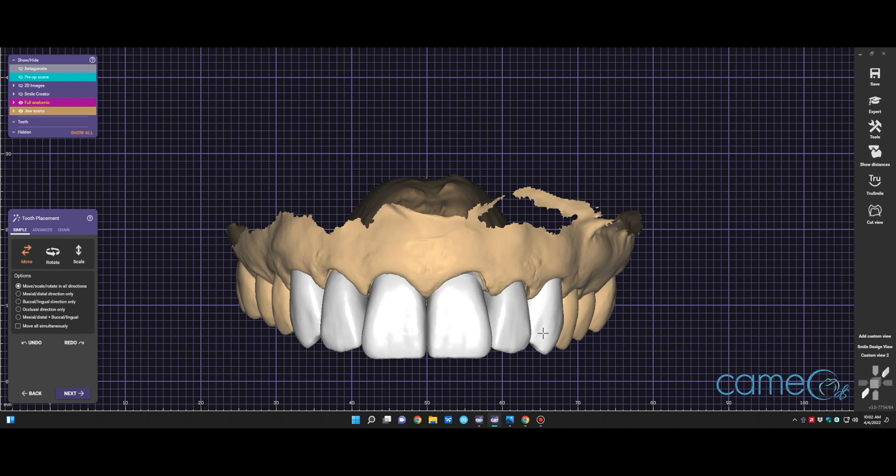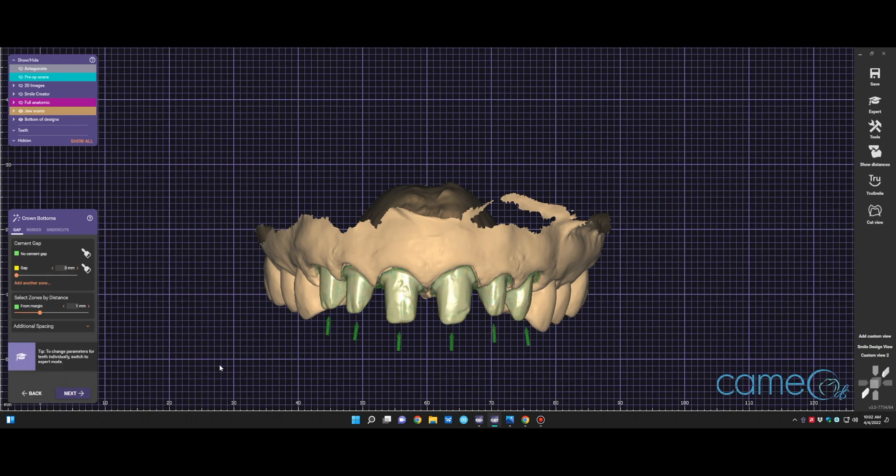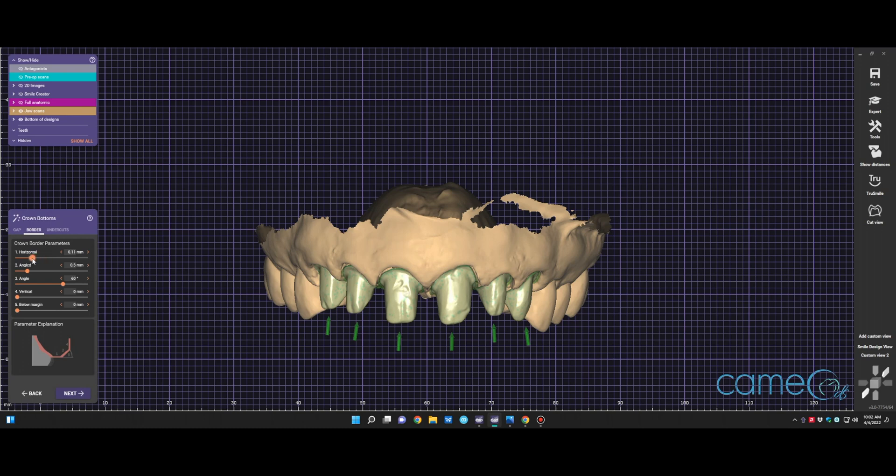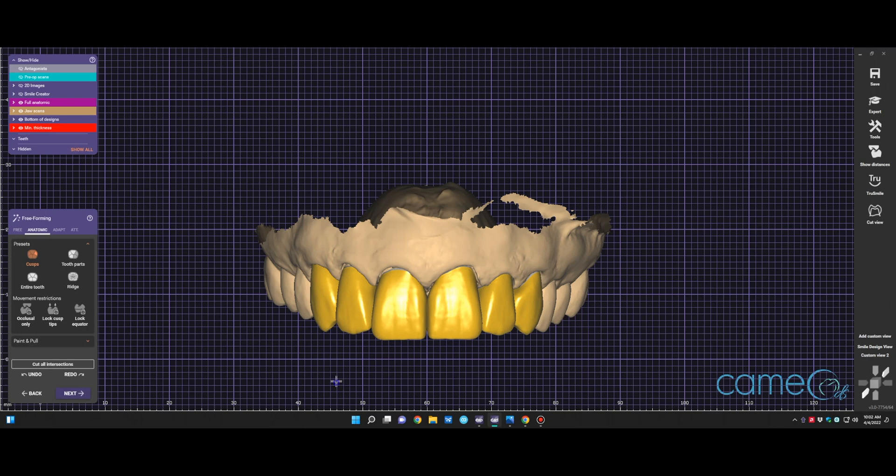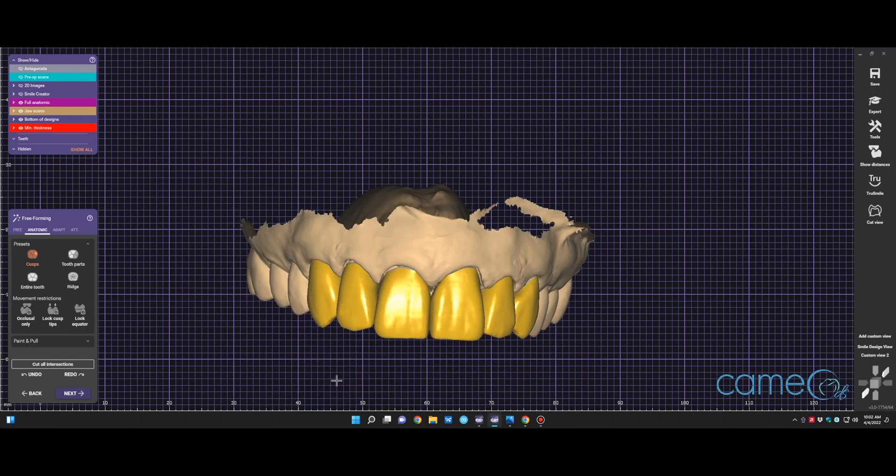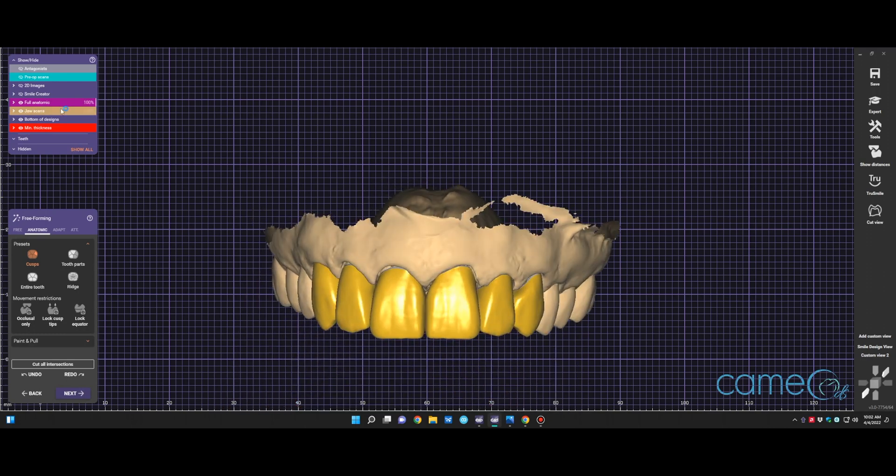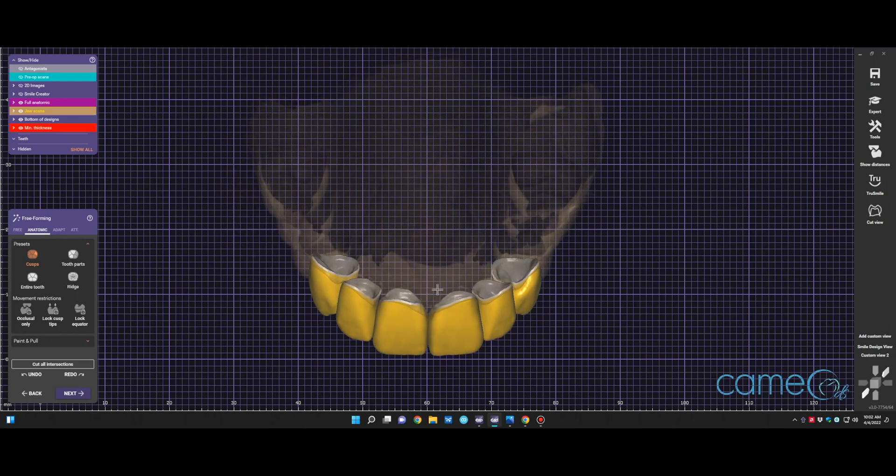So once you click next, I believe it moves us on to the morphology or changing the shape and contours of the teeth. Oh, sorry. We are going to get the cement gap and ultimately you're making the cement gap as big as you can and expanding it as far to the edge as you can so that it's likely going to fit more easily. You don't do that on your final crowns, but on temporaries, it's a great idea to do. It ensures they fit more easily in the mouth. Then you click next.